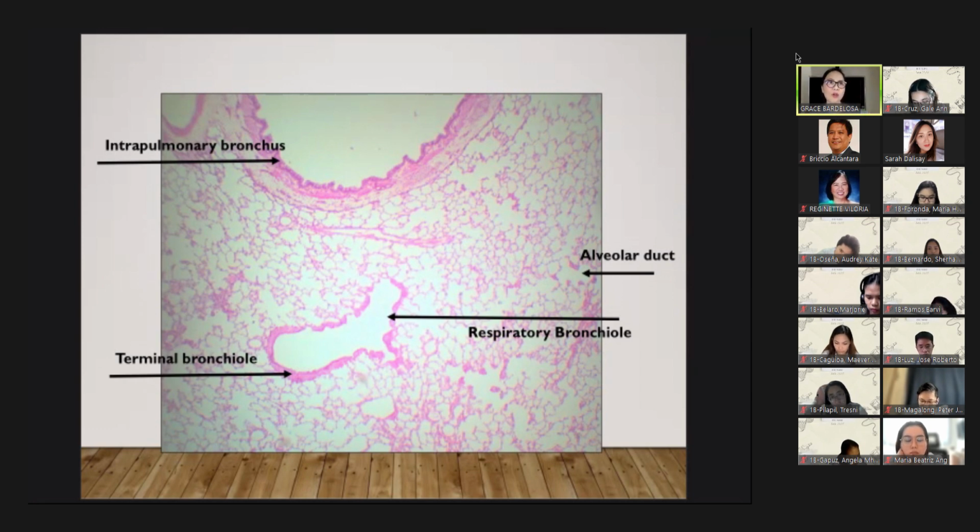So what is the bronchiole made up of? It's ciliated columnar cells alternating with cuboidal cells. And because it is composed of very thin smooth muscles, there is contraction of the lining epithelium. But no more, it is devoid of glands and also of the cartilage.